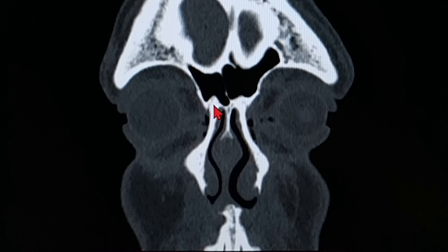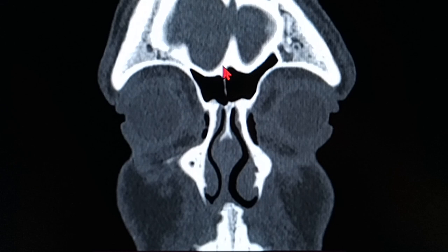Going behind, this is the brain on the left side. That's pretty common to us right now. The bone is disappearing, and in some time the entire bone is going to disappear, and we're going to have a clear picture of the entire forebrain, that is the frontal lobe. Okay, so same thing over here now. In some time we're going to start seeing the appearance of the maxillary sinus. As we see the glimpse of the maxillary sinus, one interesting thing is going to happen: the frontal sinus is going to disappear, the frontal floor is going to disappear, and eventually the frontal recess will start. So I'm going to show you how to identify the beginning of the frontal recess and where you should stop to call it as frontal sinus.